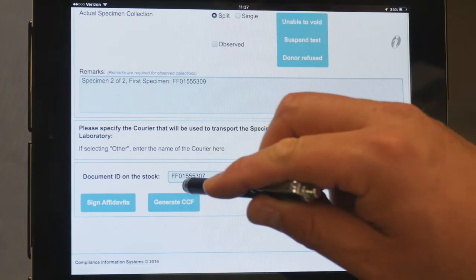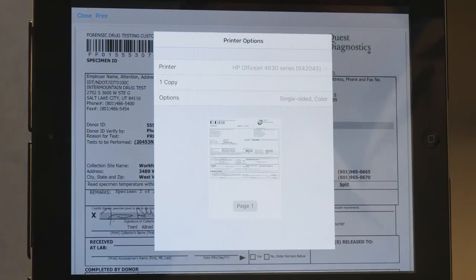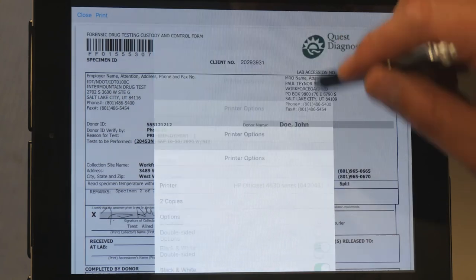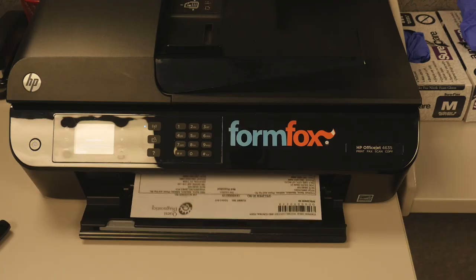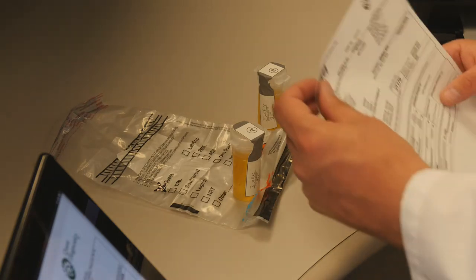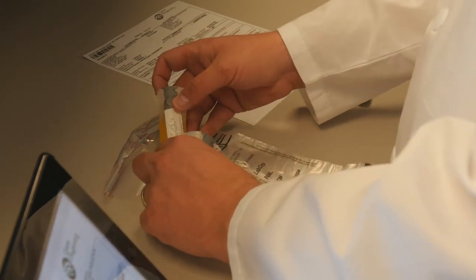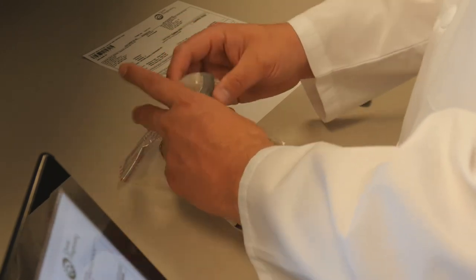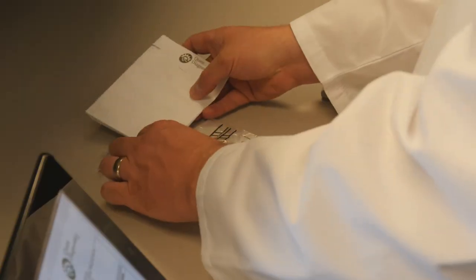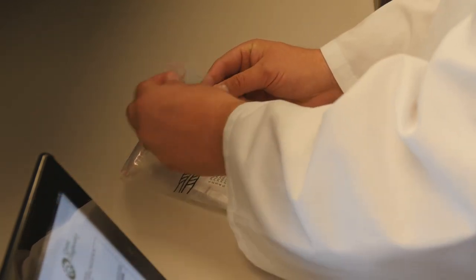The final step is to tap the Generate CCF box and print. Observe the CCF, including donor name, from the preview window. Print the CCF from the preview window, and assure it prints legibly before closing. At this point, you should print a copy for the lab and one for the donor. All other copies can be transmitted electronically. Select Finish to close the record. Give the donor the donor copy of the CCF. Package the lab copy of the CCF inside the bag with the sample and attach labels on the outside of the bag so it can ship to the lab.